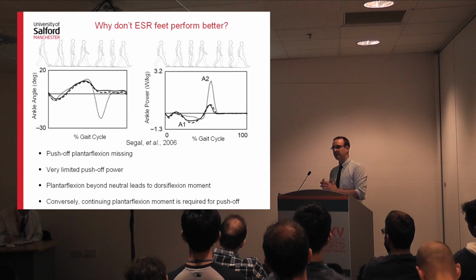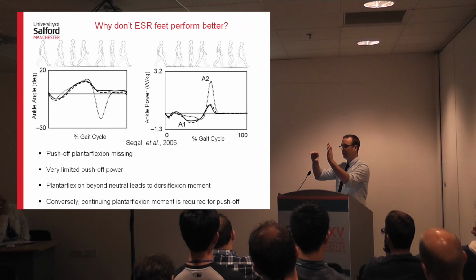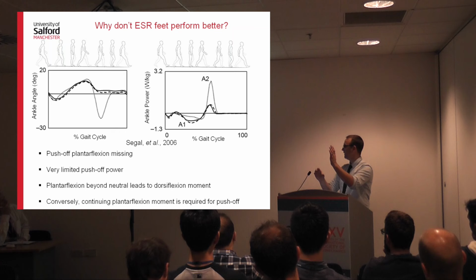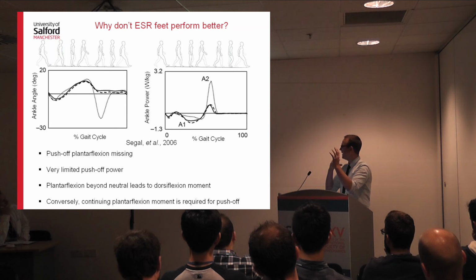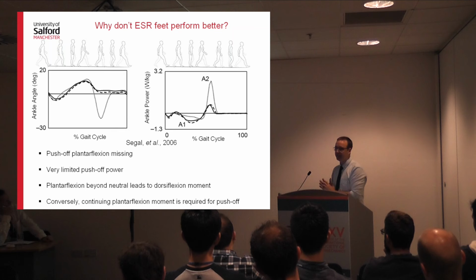And if you think about the design of most prosthetic feet, it kind of makes sense from an engineering perspective. If the neutral angle is at 90 degrees, what the natural ankle does is it plantar flexes down, so you push your toes down and you're producing a torque in that direction at the same time, and that gives you the push-off power. But if you take an ESR foot and you bend it in that direction, it naturally wants to return back to its neutral position. And this is the exact opposite of what we want at this point in the gait cycle. We want plantar flexion angle to be increasing and a plantar flexion moment. So it's something inherent in the design of ESR feet that they just can't provide this push-off power.